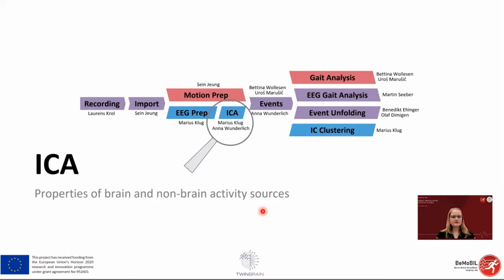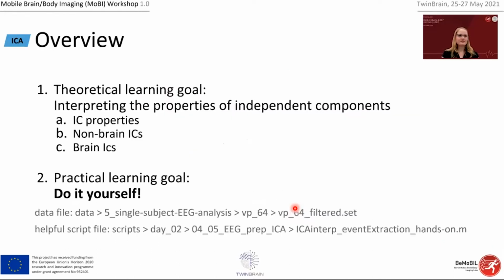So these 2 steps are not part of the pipeline itself. The code that will be shared, or that I uploaded and you may have downloaded already, is a separate file and is just customized to the data set, but you can also just use the code lines for your analyses. You can find the files that you're going to need down here.